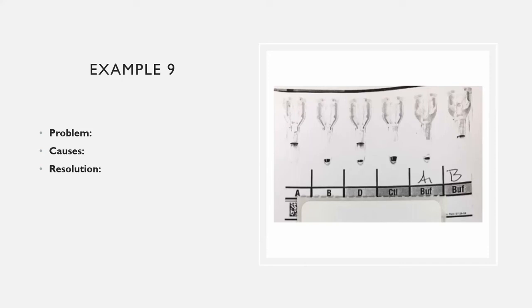Then there's partial D. You may react 2+ only. You're missing epitopes of D. If each piece of D that sticks out is an epitope, we'll call these epitope 1, 2, 3, 4, 5, 6, and then we have a partial D that has 1, 4, and 9.